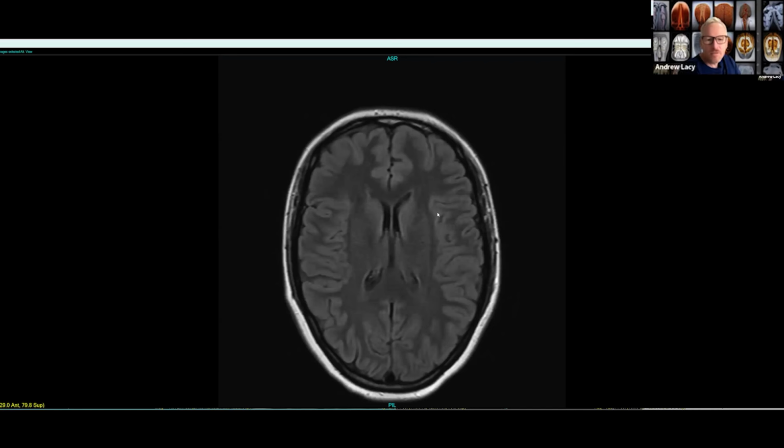And I think for a couple of areas of the body, like the brain, they also do additional sequences if they see something that's concerning. Yeah, exactly. If we saw a brain mass or too many white spots within the brain, they will add additional image sets, specifically something called susceptibility weighted imaging, to give us more information and help us characterize the process that's going on. But if they don't see anything, we generally don't add that in at this time.